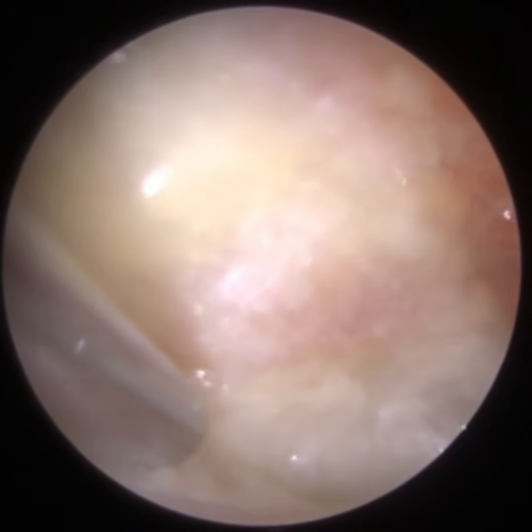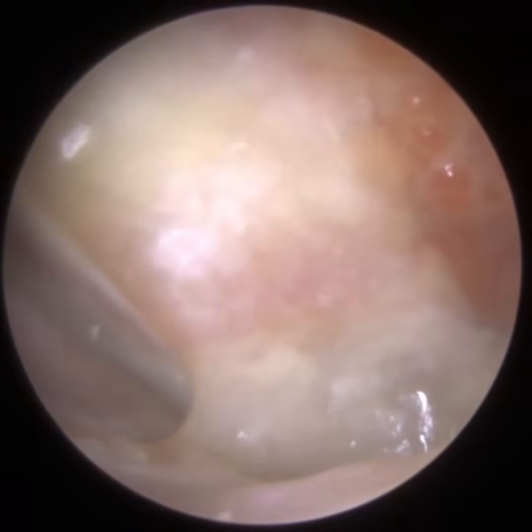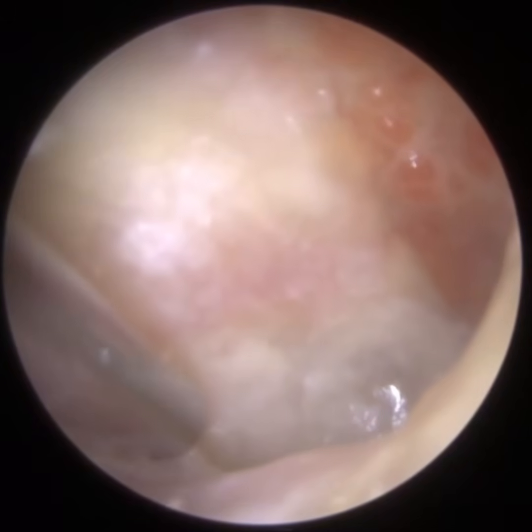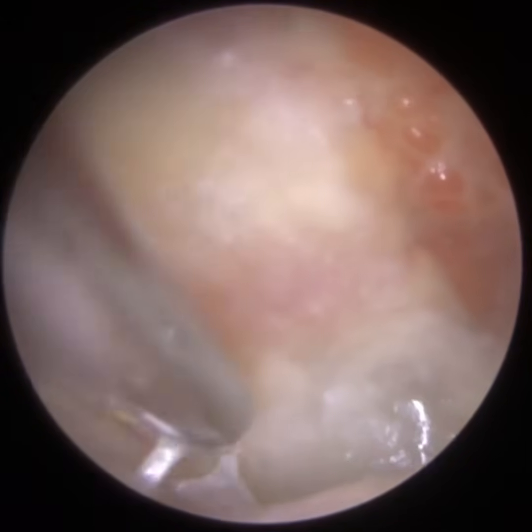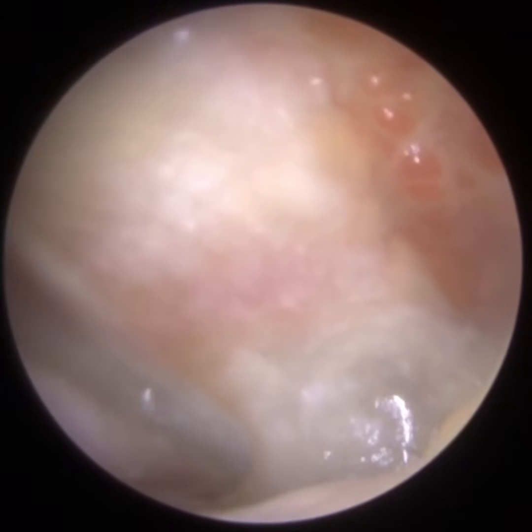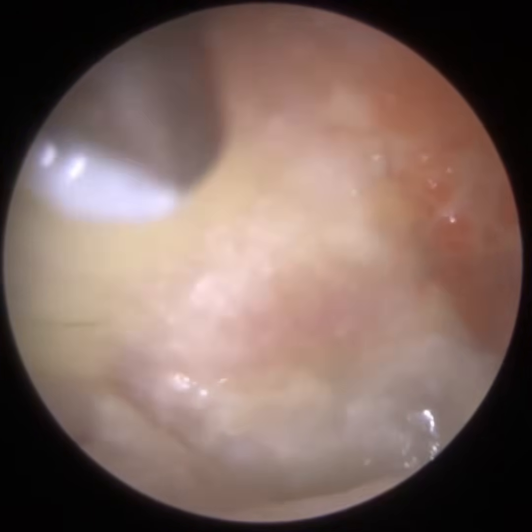It's almost like the bullseye of the eardrum. To the right, you've got the granulation tissue. So I'm just in the anterior recess here. It's quite a tedious procedure. We're trying to remove layer upon layer of dead, wet, infected skin of this patient's eardrum and also ear canal.